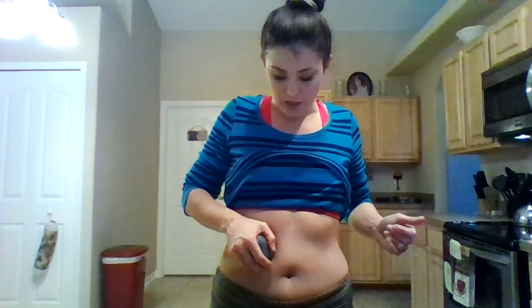So push, let go. Right now I'm not pushing any buttons. The needle is stuck in me, along with the electrode. And right now I'm giving the adhesive time to stick to my body. For some reason, mine takes a little while, so I usually hold mine for about 30 seconds. I have no clue how long it's been so far. So I'm just going to keep talking for a minute while I'm letting the adhesive stick.